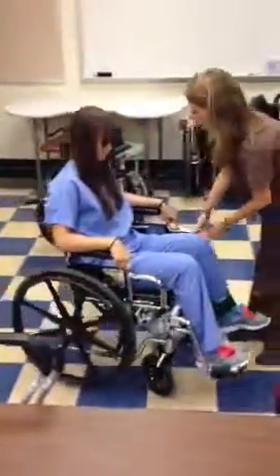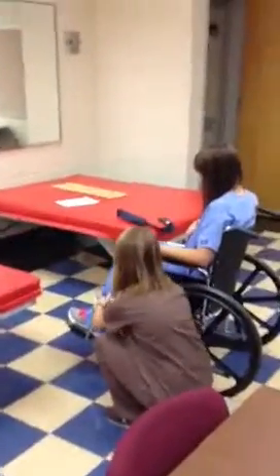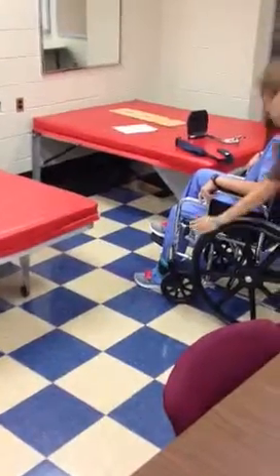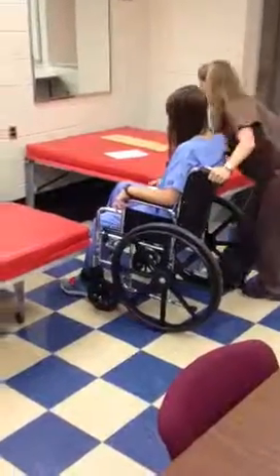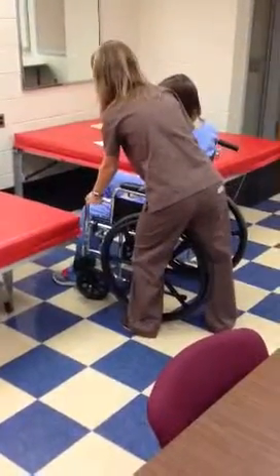We are going to go lay in bed — you did so good today. What are you going to do the rest of your afternoon? Watch TV. Nice. I'm going to stop it right here because I'm going to take this off. Now we're going to walk our wheelchair to this side. Watch this arm — I'm going to move this armrest for us so we can get in bed.